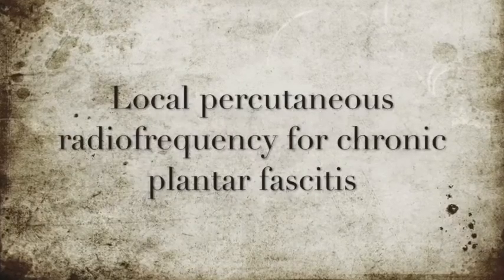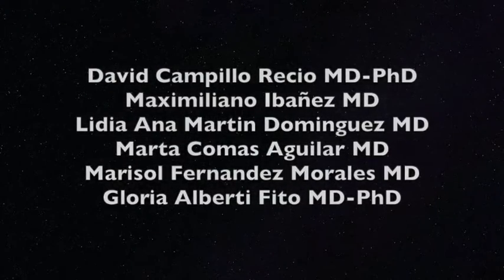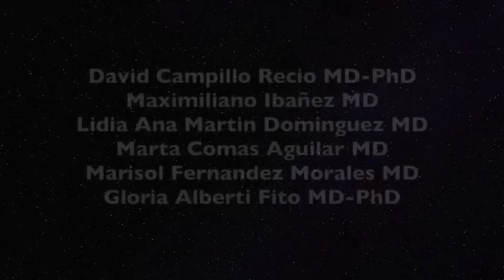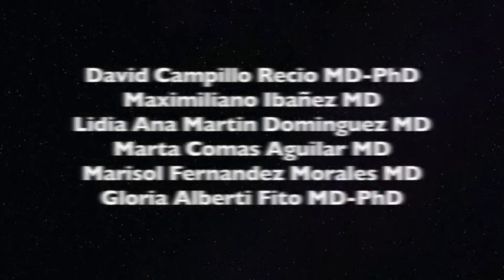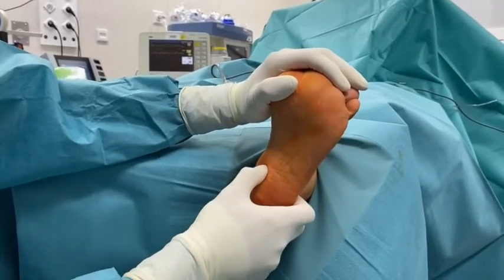Local percutaneous radiofrequency for chronic plantar fasciitis. The patient is positioned supine with the ankle dropped and hanging freely over the edge of the table.